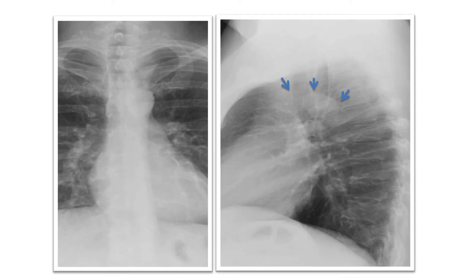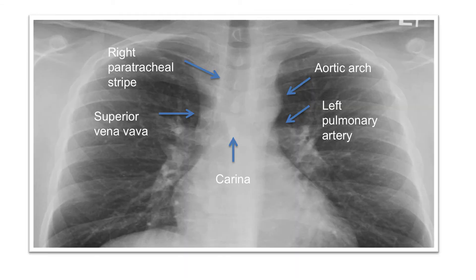The aortic arch can also be seen on the lateral X-ray as a white arch coursing from front to back. Because of its shape and gray scale, the trachea can be easily identified on the chest X-ray. We can now use the trachea as a landmark to identify other anatomical structures such as the carina, the superior vena cava, the right paratracheal stripe, the aortic arch, and the left pulmonary artery.